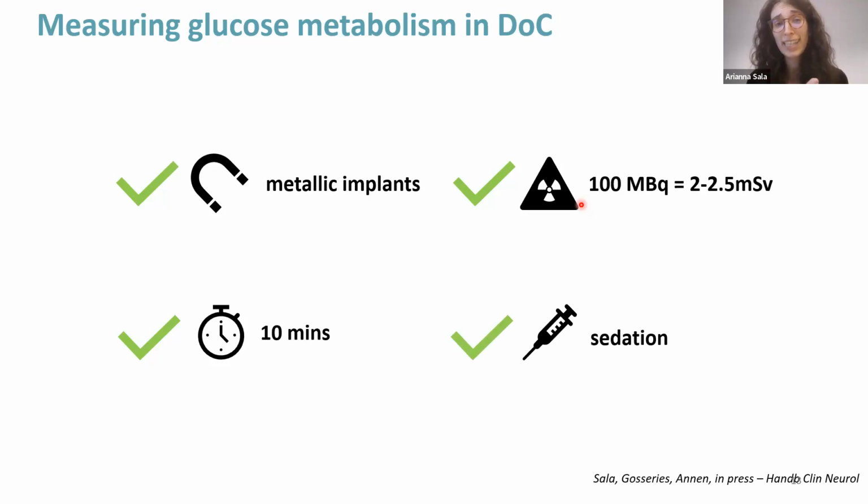And sedating the patient to avoid movements is not an issue. This is because when we do the injection, we have to wait 30 minutes before putting the patient in the scanner, because the current protocols use simplified measurement and acquisition procedures. So we inject the patient, and we don't need to do any kind of sedation at that time.